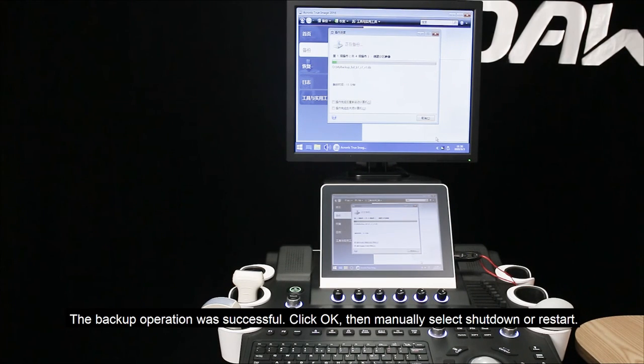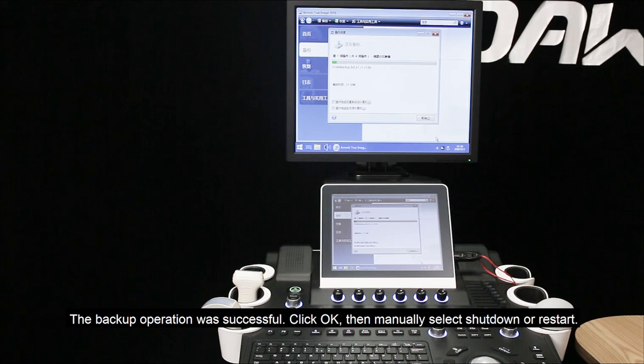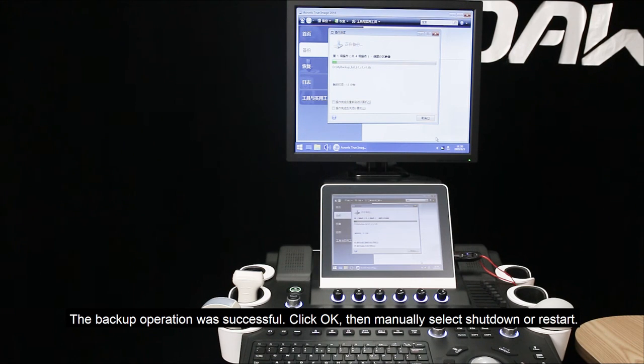The backup operation was successful. Click OK. Then manually select shutdown or restart.